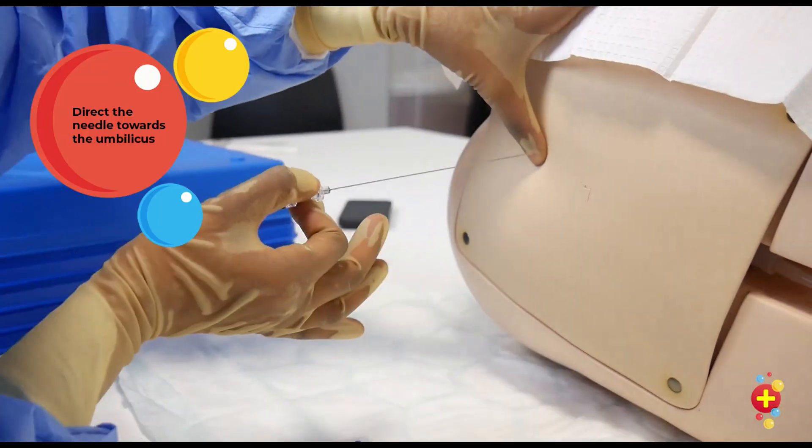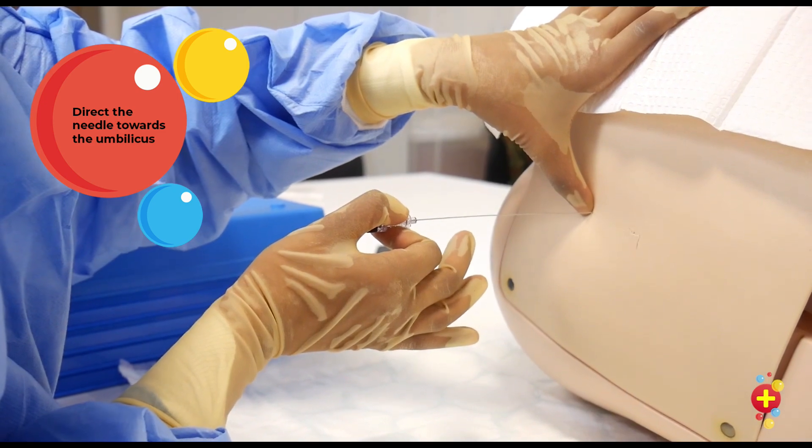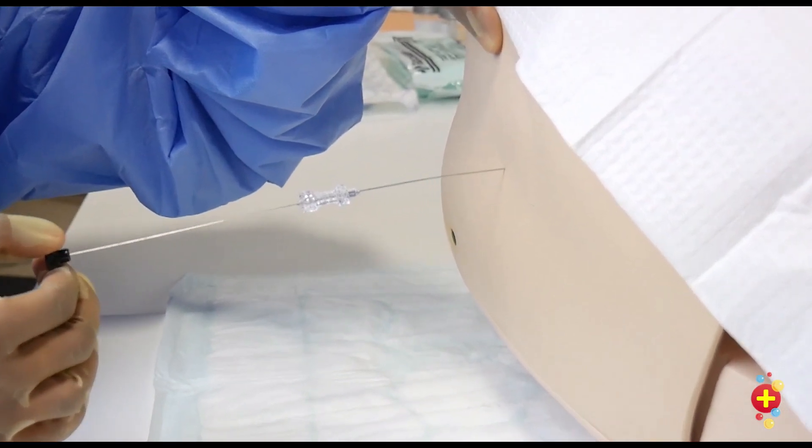Getting the patient into position. You're aiming the needle towards the belly button. Now that I've felt a pop, let's check if we're in the right space. We're looking for CSF.